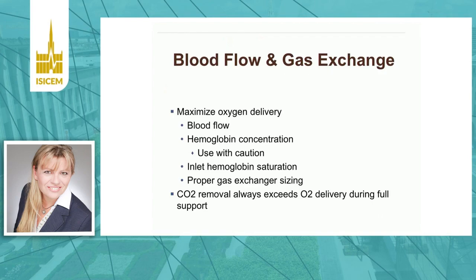So of course, in all this cannulation management, the size of the cannula, the length of the cannula, and its position aim to maximize oxygen delivery. It also depends on blood flow and hemoglobin concentration. It should be used with caution, and proper gas exchanger sizing is also needed. And CO2 removal always exceeds oxygen delivery during full support.